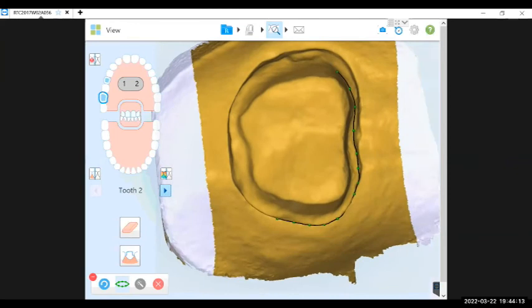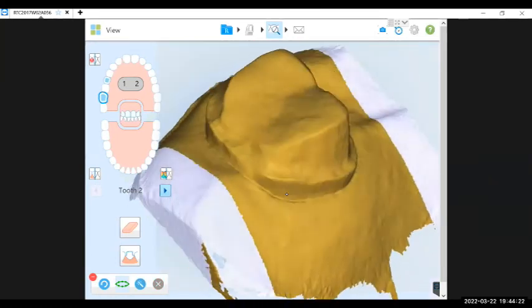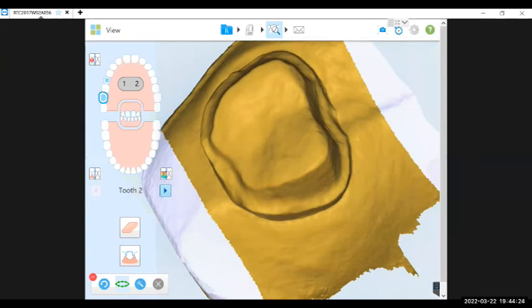On the rare occasion, there's an anomaly, a defect in the anatomy of the tooth. There's a furcation, something that's unusual that you might find the need to really want to mark the margin yourself. But outside of those examples, I really find that it's the laboratory technicians who are the experts at marking margins. I mean, they mark margins all day long.